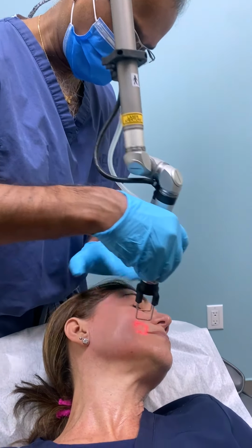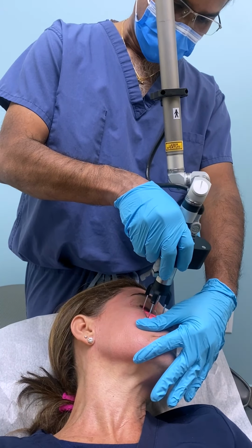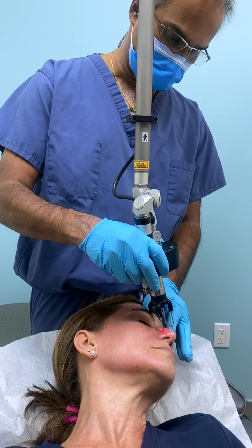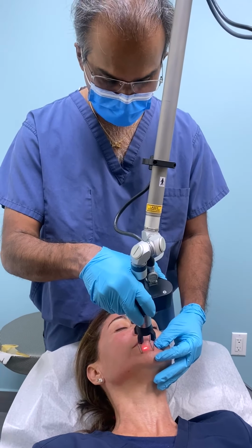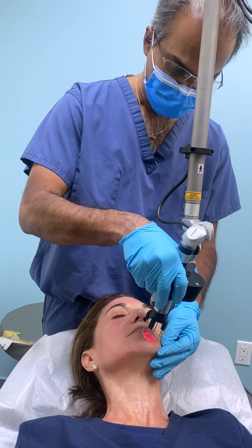And that's one of the things that I want to clarify for you, which is that, back several years ago, before the laser technology and the delivery mechanisms were as sophisticated, and doctors frankly didn't know any better, the treatment was extremely aggressive and really created significant injury to the skin, temporarily, that heals with scabbing and swelling and redness and all that. It did give a good result, but it took a lot of time to heal.